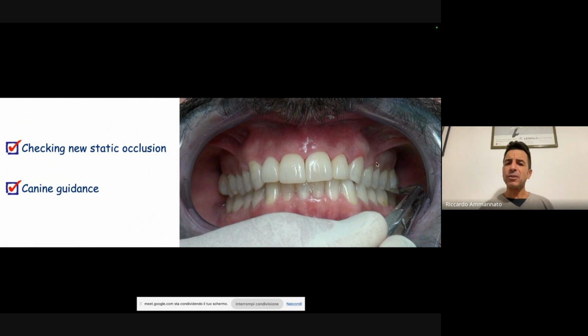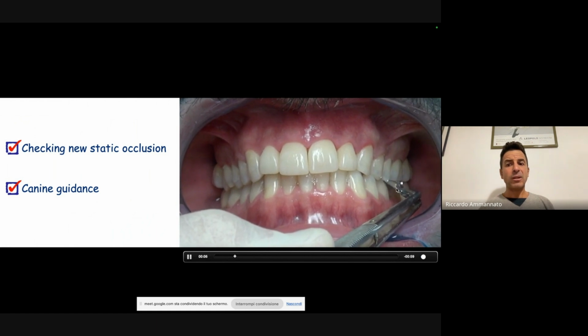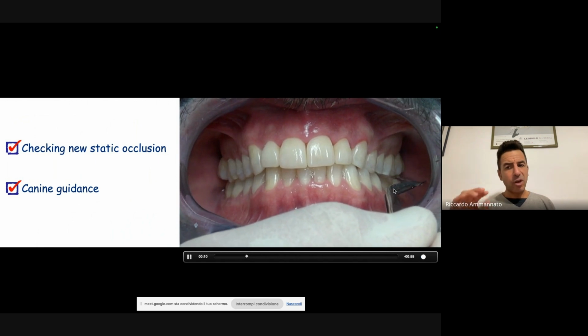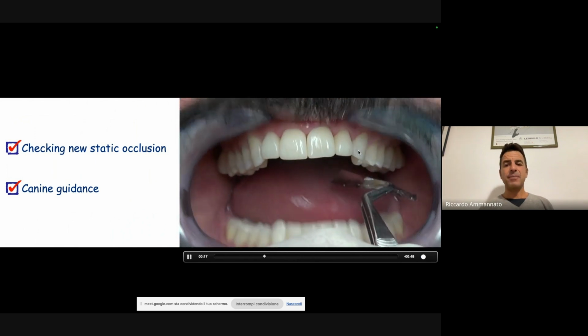This is a short video, just you can see there, I'm sorry about this, some inflammation, because it's just one day after we managed all the restorations and I did the occlusal adjustments, and then I want to just see if I reach my goals, which are a static. In the static occlusion, I want to have contact points with my shim stock that is 8 microns, held from second molars to the canines, okay?